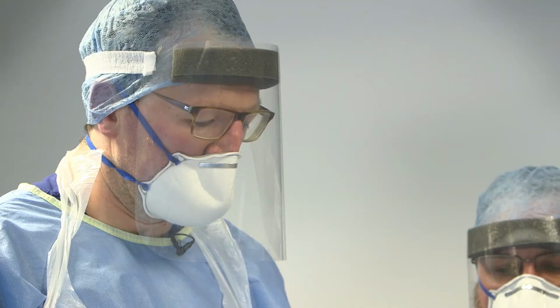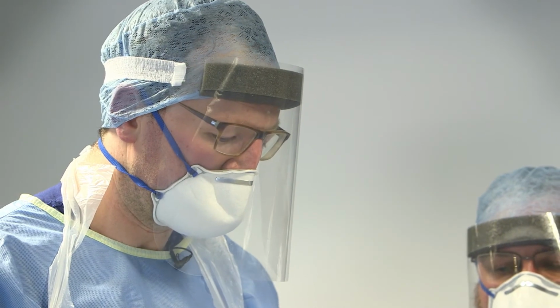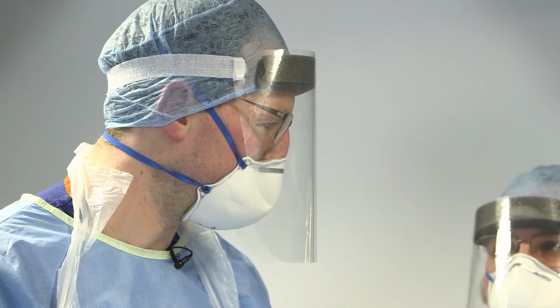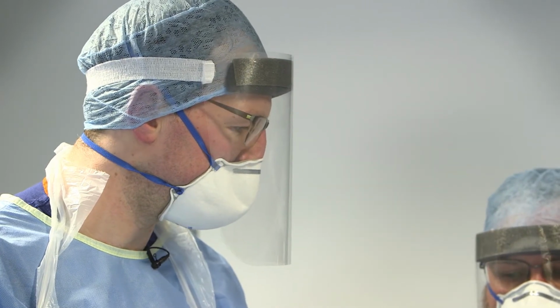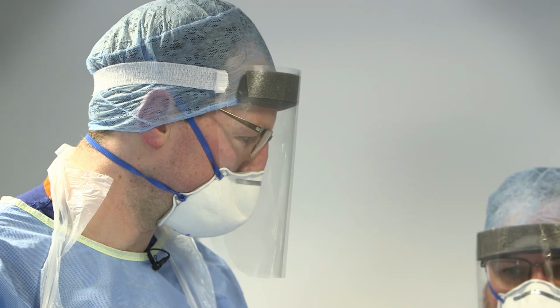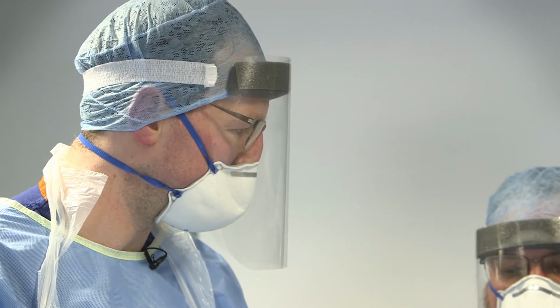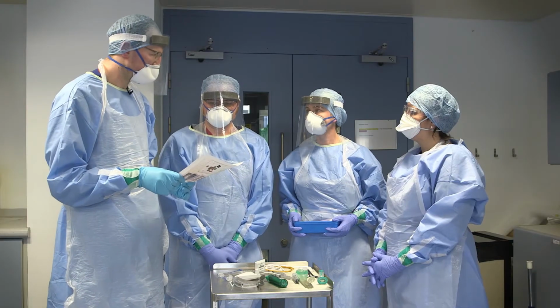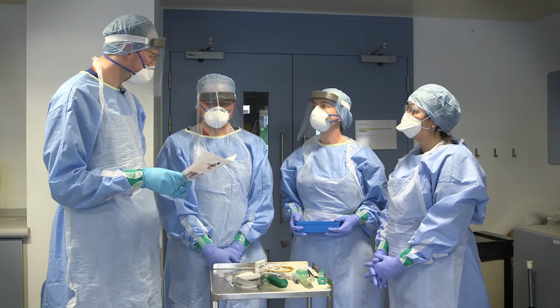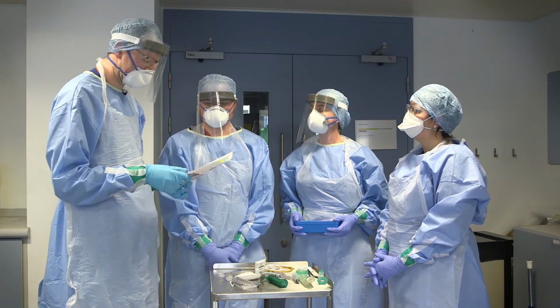Following successful intubation, we need to ensure that we have a secure airway before ventilating. So Trevor, I want you to inflate the cuff while I attach the water circuit, and I'm not going to ventilate the patient until I'm happy that the cuff is inflated. Okay, does that all make sense? Yep. Everyone happy with the plan? Okay, so it's time, I think we can move inside the room.